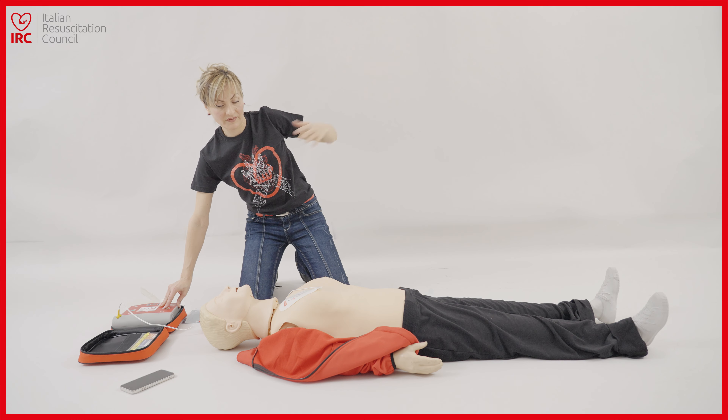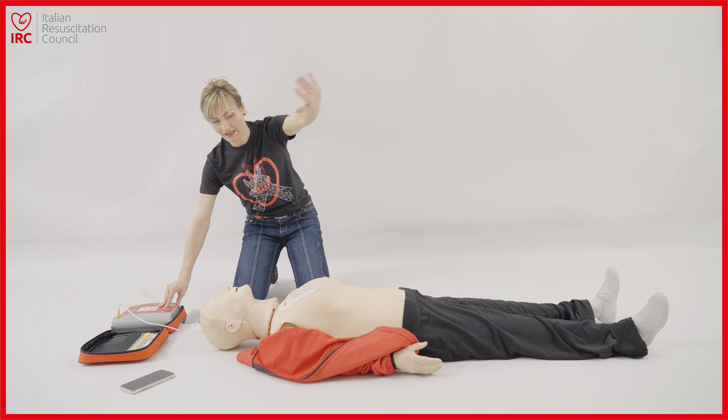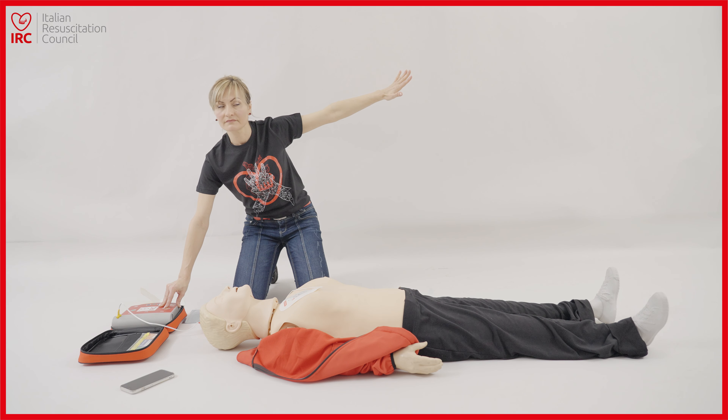Scarica consigliata. Carica in corso. Effettuare la scarica adesso.